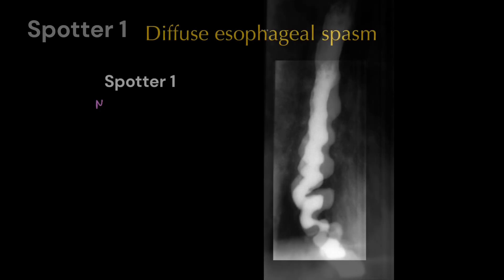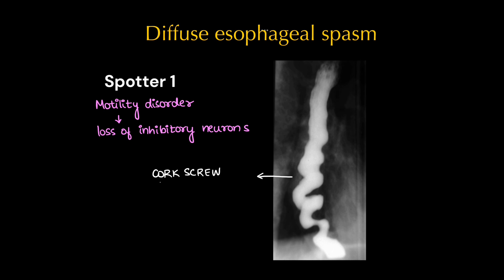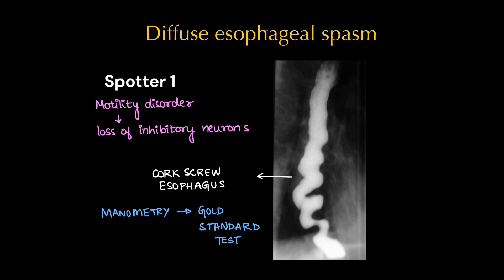This is a classic spotter of diffuse esophageal spasm. It is a motility disorder of the esophagus where there will be loss of inhibitory neurons, which will cause peristalsis that looks like a corkscrew appearance. The diagnostic gold standard test would be manometry.